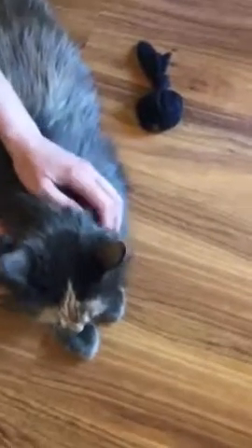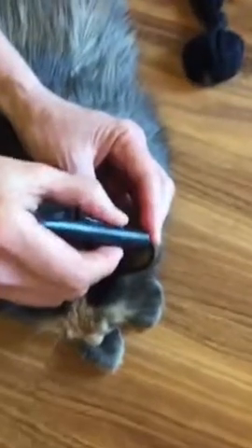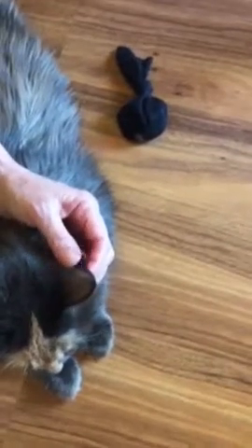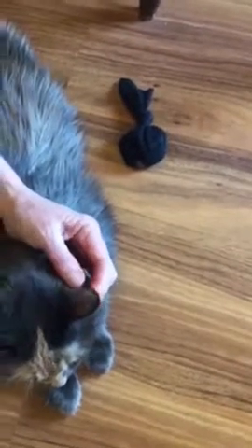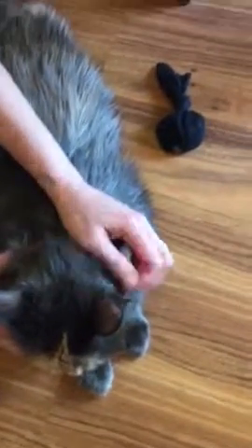My other cat ran in here and startled her, so I just calmed her down again. Then I just poke her ear — see, it's not even hurting her. I may not have got blood the first time because I didn't warm her ear. That's why it's important to warm her ear first. I'll poke again — and I'm still not getting blood. Sometimes this happens.